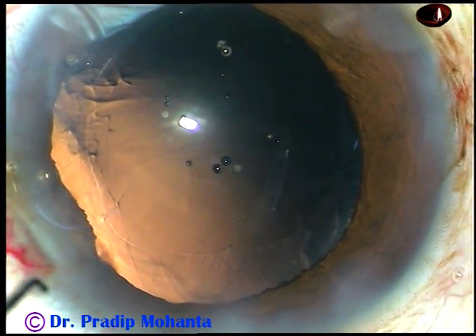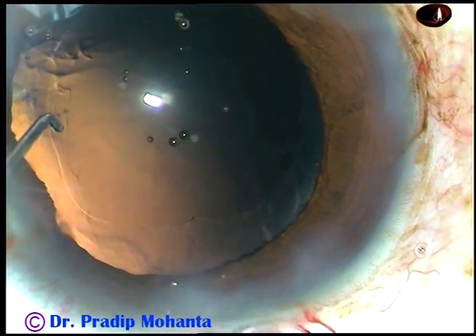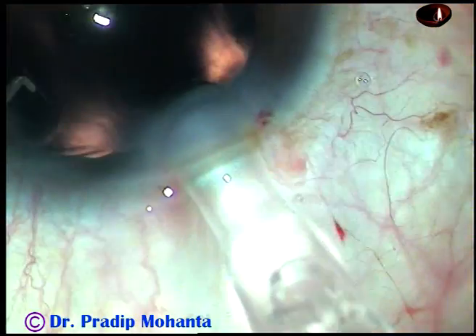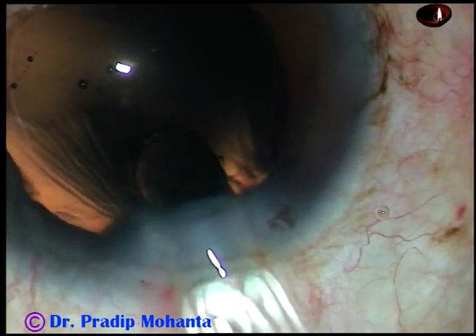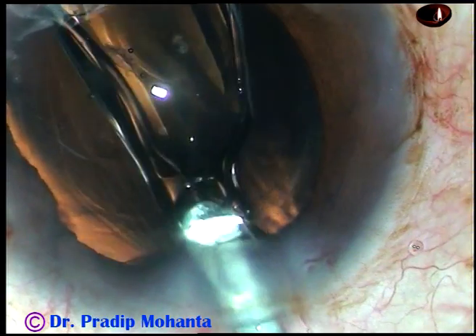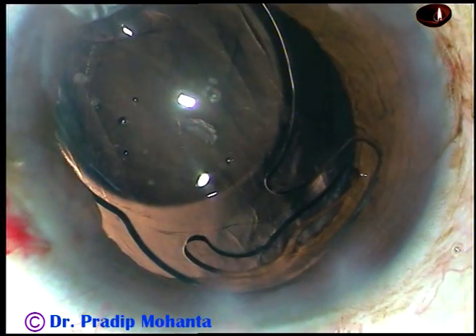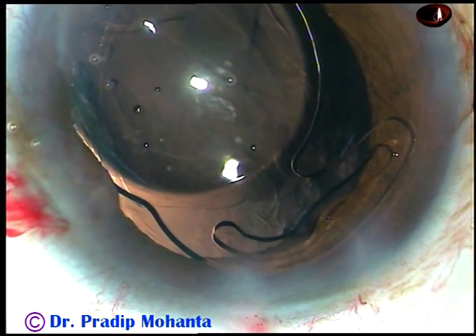And now here goes the intraocular lens. This is the leading haptic going into the capsular bag. And the trailing haptic is placed over the iris.